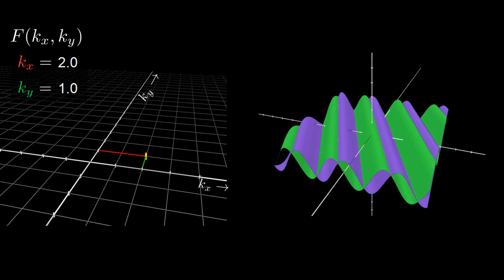Also like 1D sinusoids, our 2D wavy sheets extend infinitely in x and y, though I'm cutting these into tidy squares for display here. The kernel for 2D sinusoids is just the 2 1D kernels multiplied together, e to the i kx x times e to the i ky y, or adding the exponents, e to the i (kx x plus ky y).